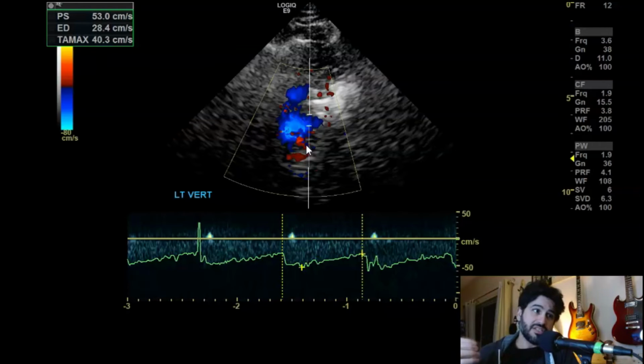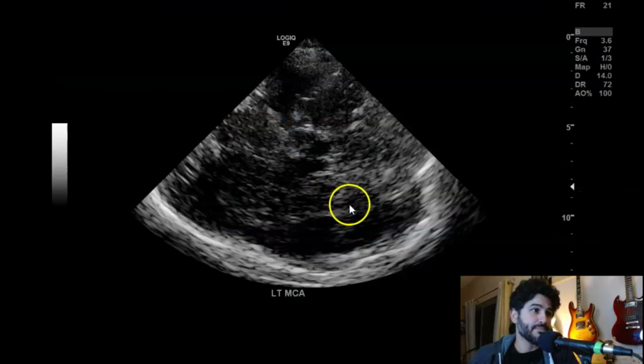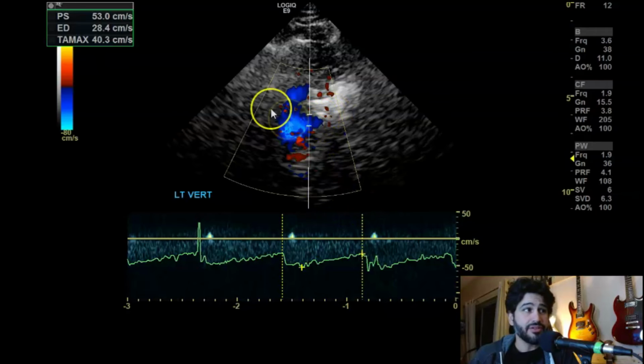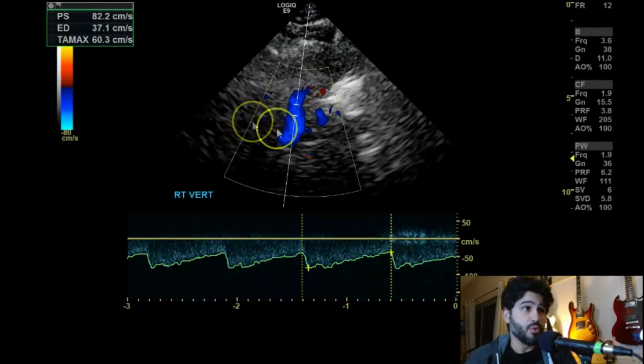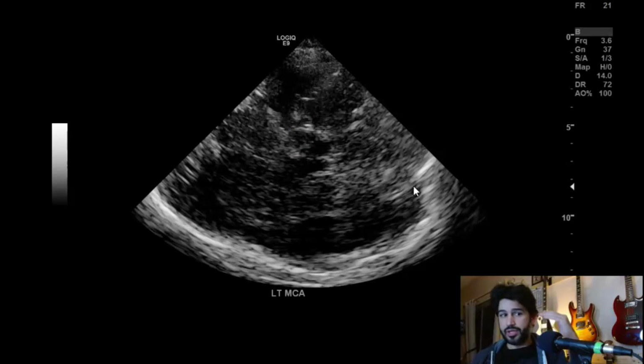But the people who developed TCDs, they did it using continuous wave Doppler machines with no angles. And those are the parameters that are used, and those are parameters that are still used. So we don't use any angles on any of the arteries. So if I were to put an angle there, this flow might be a little higher, closer to the right one. What you can do is also change your approach and try to get that vessel to become more parallel to the beam of the ultrasound. Boom. Done with that.